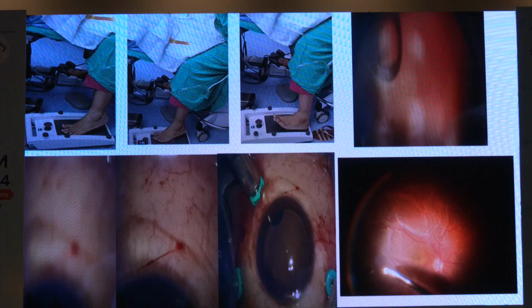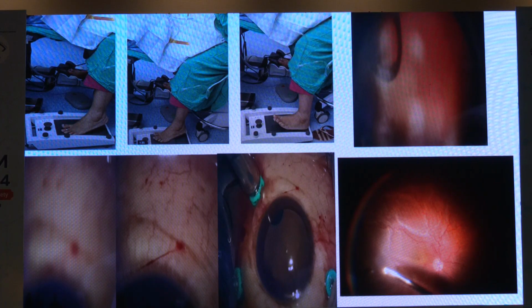First thing that I do is increase the magnification to the maximum. Then I focus at the limbus vessels. Then after that, I will bring it back to a level where all three sclerotomies are focused. After that, I will again take the light pipe inside, focus it to the maximum, bring the maximum magnification once more. Now I focus the disc. Then I decrease the magnification again so that the entire retina is focused in one image. So during the entire surgery, now I don't have to move. The whole retina is going to be focused in one.